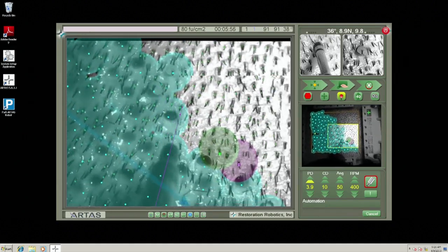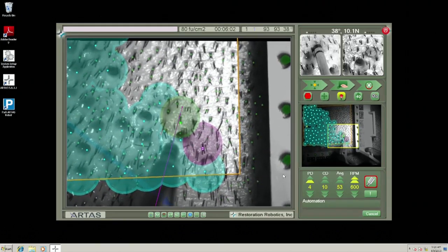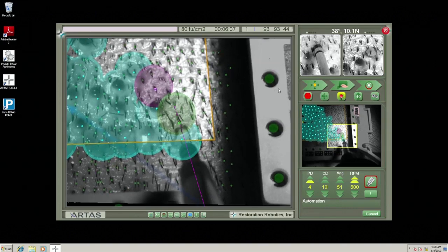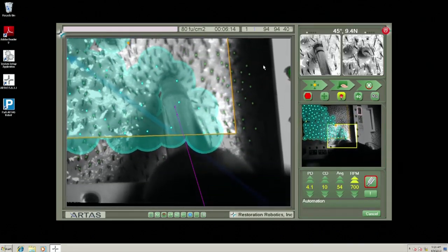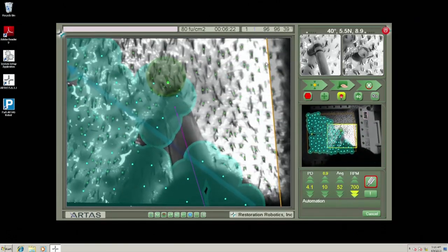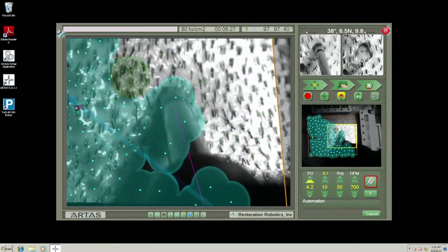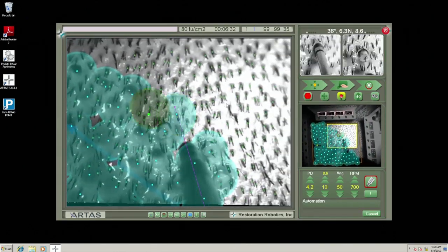Now, when you look at all the green dots, we refer to the green dots that are over the entire field here, and there's hundreds of them. Those represent grafts. Those represent hairs that are multifollicular units that are sticking out. And so if you have the hair too long, and the hair in this procedure needs to be about 1 to 1.2 millimeters in length. If it's much longer, then you get overlap of the hair shafts. Now you can see, if you look across the board here, you'll see that the hair shafts don't touch each other for the most part.